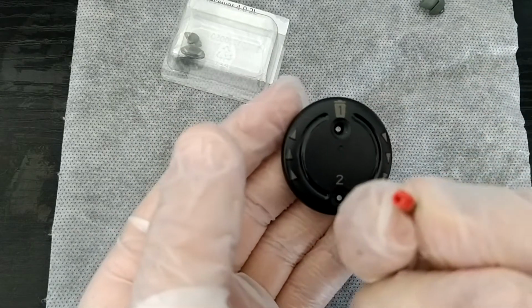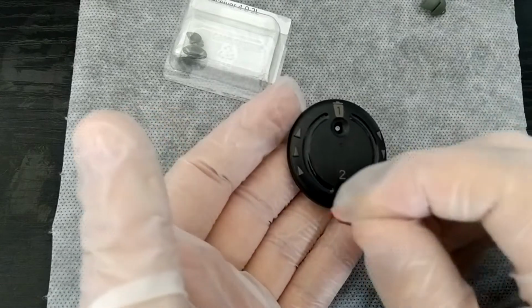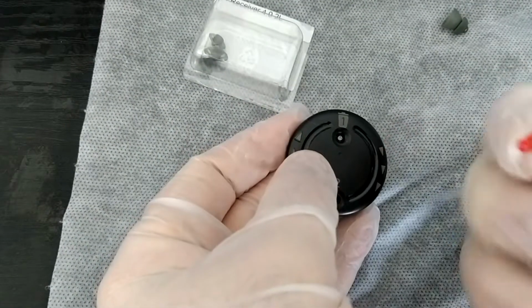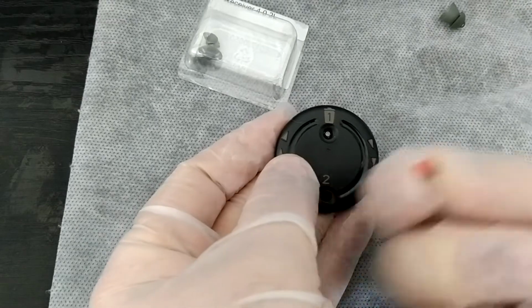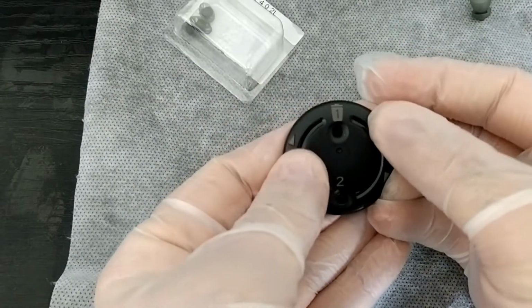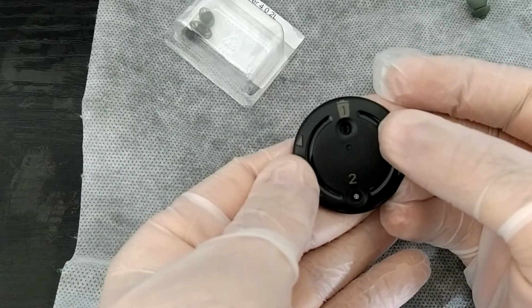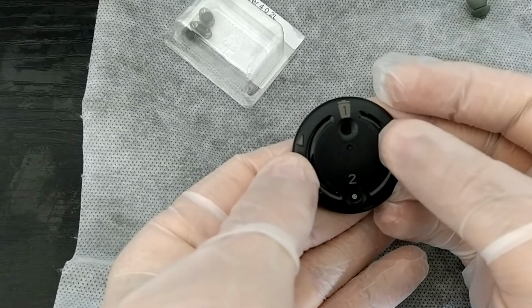So you can see there's an open hole. Once it focuses, then you put it in position number 2, and you put it together, and now you've got a fresh disc. So that stops any wax from getting in there. Make sure you turn it again, and then into position again, so you're ready for the second one, or the left hearing aid, assuming you have 2 hearing aids.